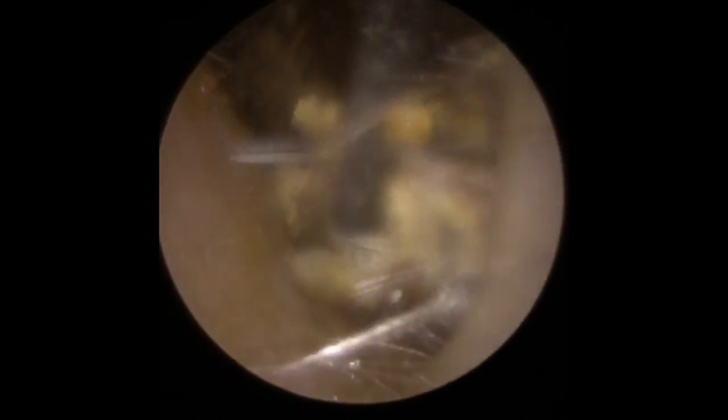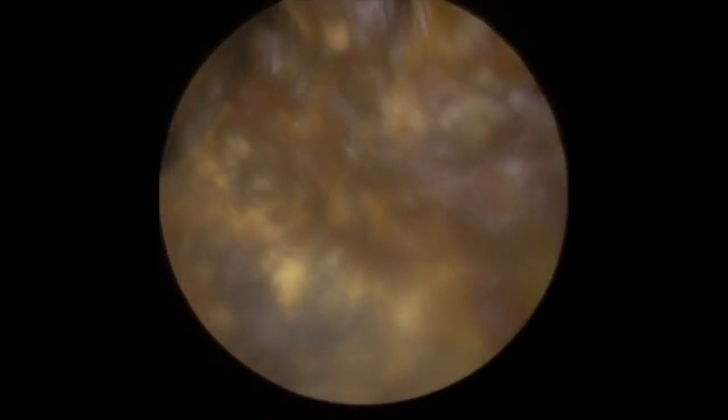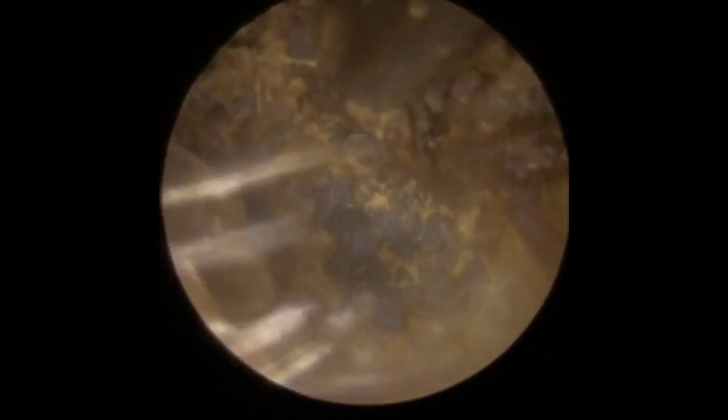We've just broken another piece off the front end there. So what we've got now is a large dry plug that we can just start to bend and move a little bit, just to try and encourage it out of the canal. Now what I'm looking to try and do — I can't get above it, I can't get a ledge on it because it's in too deep and it's too flexy. So I'm just going to tidy up some of the bits first with microsuction, and then what I want to try and do is take this off the canal wall. I know the outer section is really tough, so I'm hoping I can use the outer section to get a grip and hold everything together with that, and then pull it out in one piece if we can. To make that a little bit easier, I'm just going to bend some of the outer sections into the centre first.